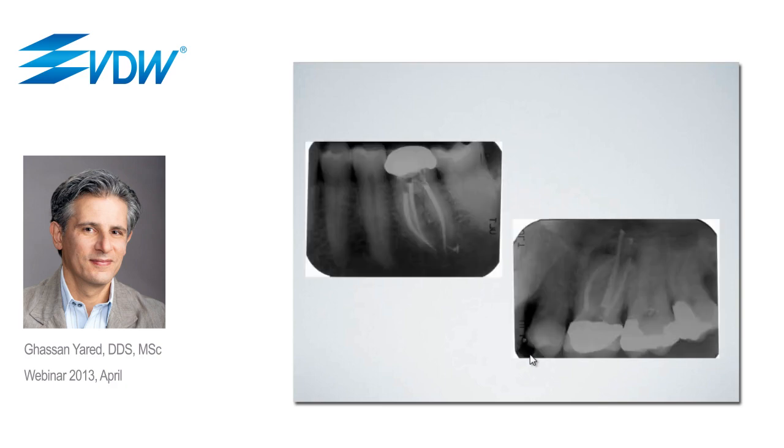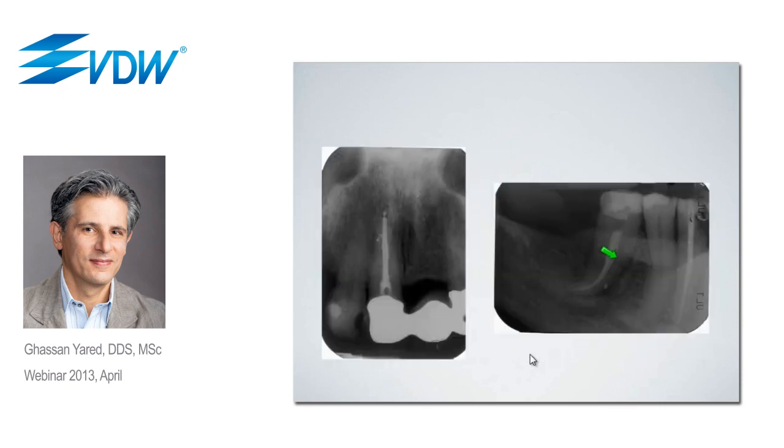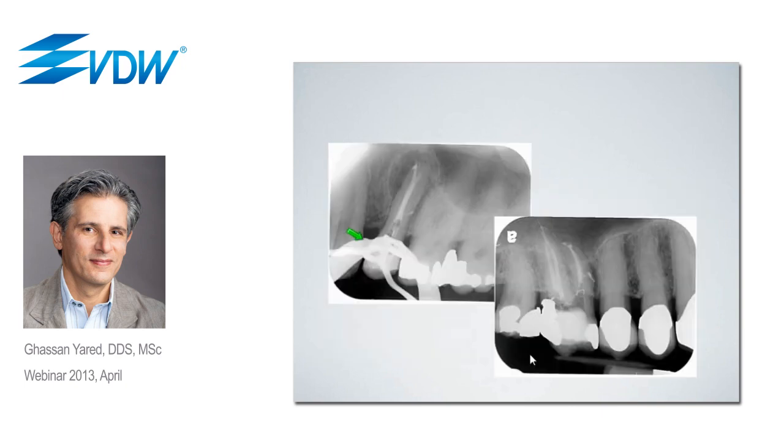premolars in the apical third, molars, apical third, and middle third here, and this palatal root. Again, apical third, apical third. So it is possible to fill lateral canals if that is important, even when we do single file reciprocation. Here, lateral canals in the coronal third and in the coronal third. So filling lateral canals is not an issue.